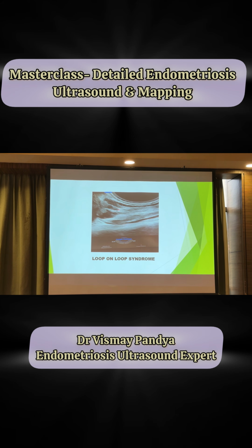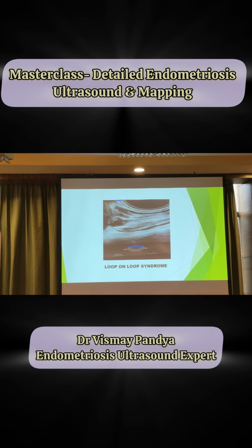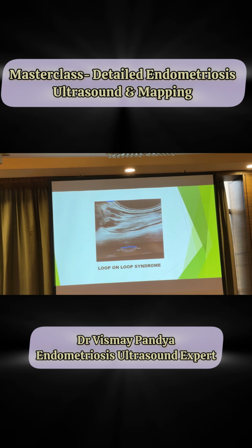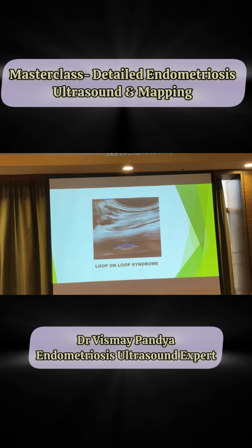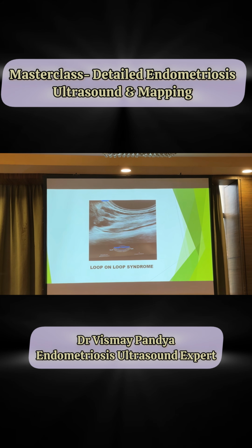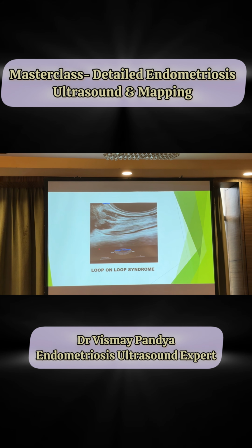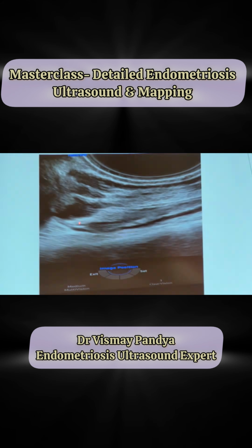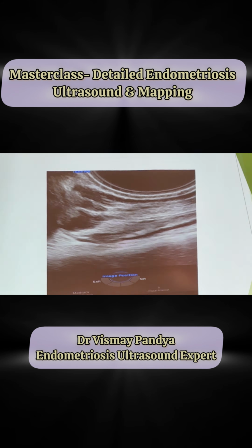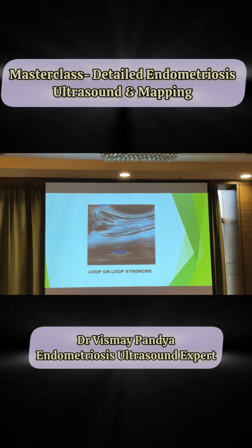Now this is something called a loop on loop syndrome. If we see very closely, you can see just one nodule adherent to the uterus here, okay? But you see this muscularis is going like this, then it is turning back like this, then it is going like this and turning back like this. So the two loops of the rectum have gone adherent. When you unloop them, it will become like a 4-5 centimeter rectum, and that might require a resection. So this is very important, because from the picture you can see, okay, it's just a 4 centimeter complete, I can do a shaving. But when you go inside, you will see that it was a loop on loop, and when you open it, you have to resect it. So a loop on loop has to be mentioned.